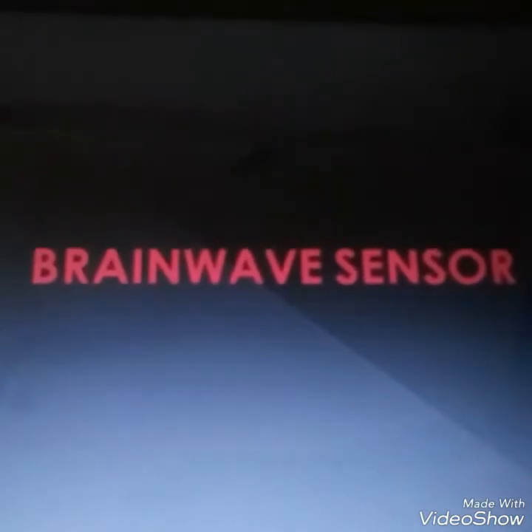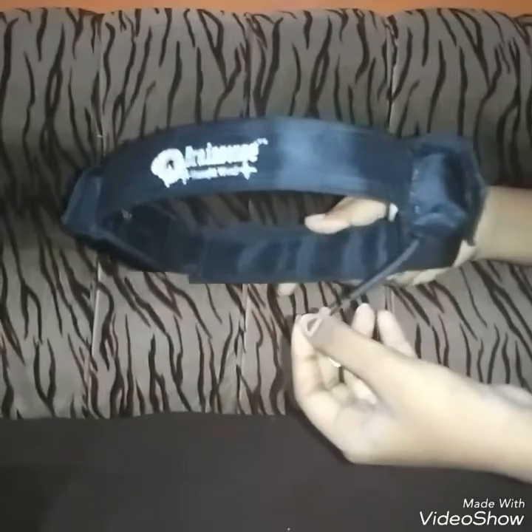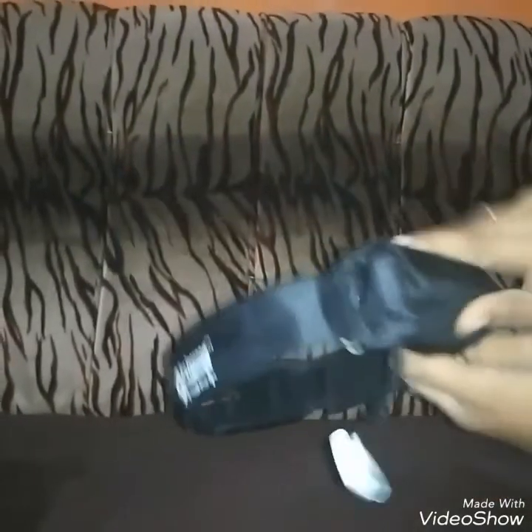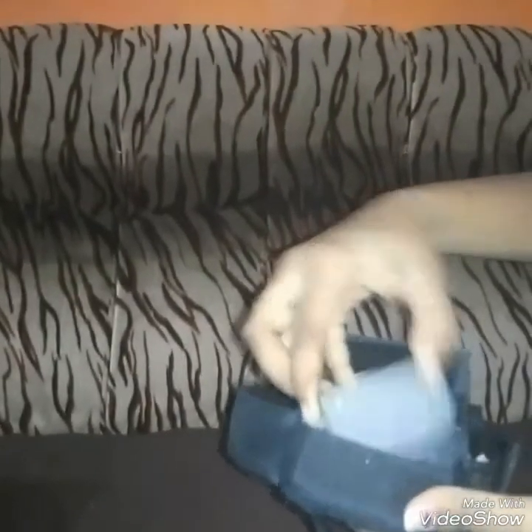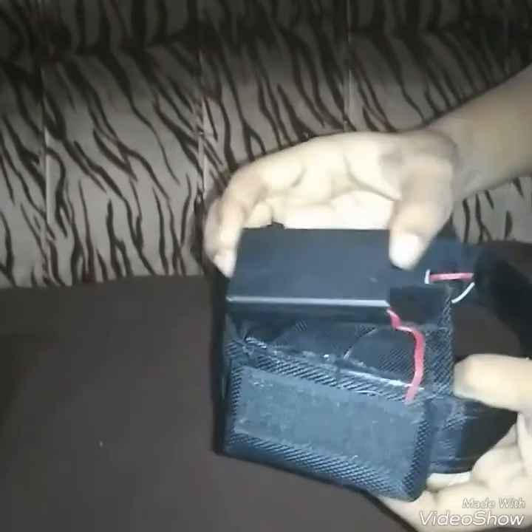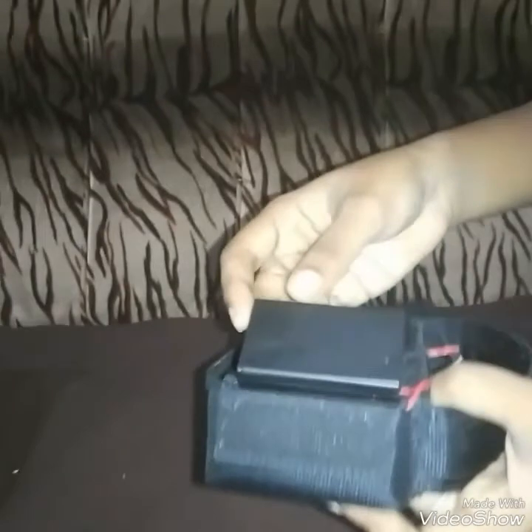Electrode cap. Now here is the brainwave sensor, which acts as an electrode cap, and this is the ground cable which is attached to your ears, and it gets the signals and passes the interrupt to the Bluetooth. This is attached to the ground cable. And here is the battery, which is chargeable, and when you switch it on and make the connectivity with the Bluetooth, the sensor works.